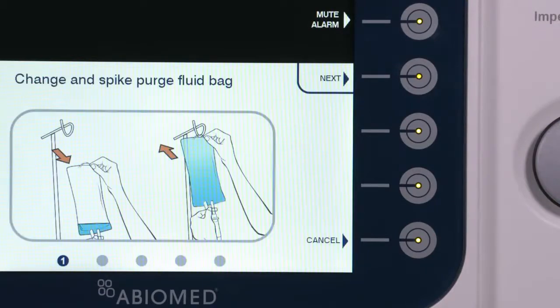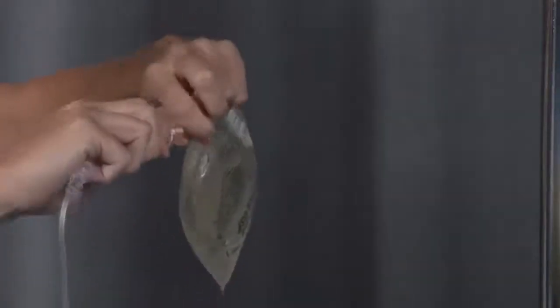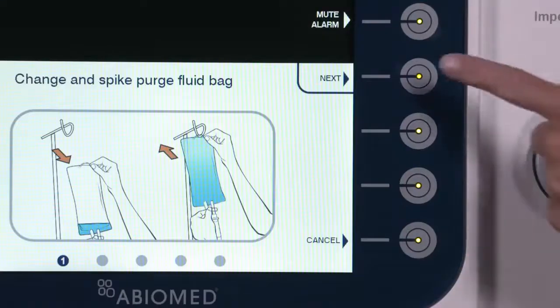Replace the Purge Fluid Bag by unspiking the original Fluid Bag and spiking the new Purge Fluid Bag. Once completed, select Next.